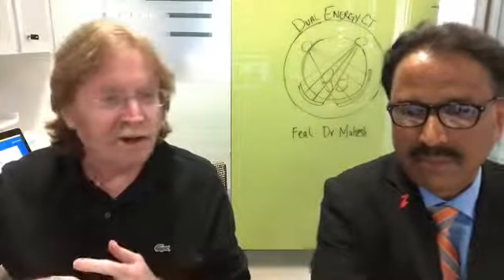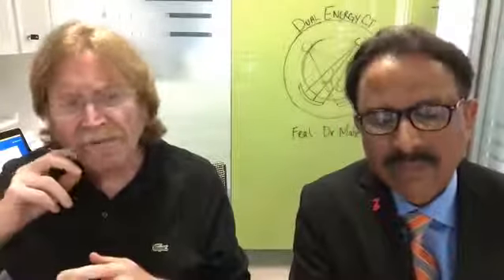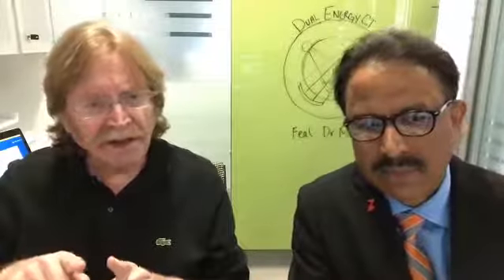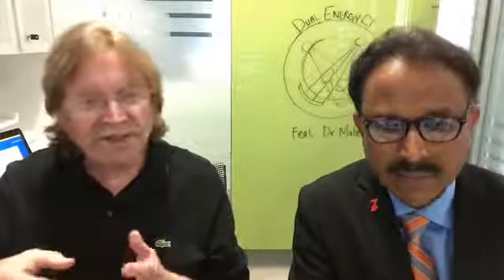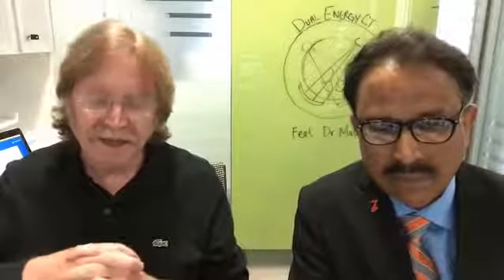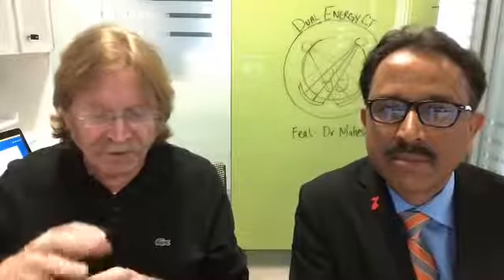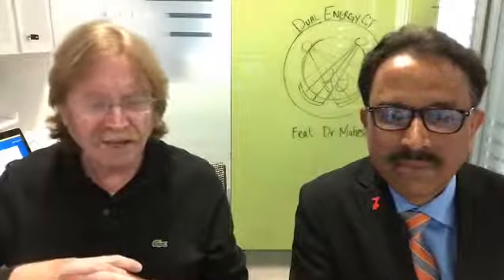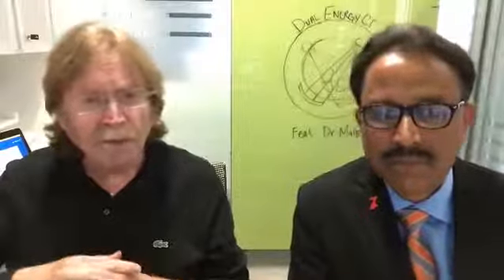We presented some work at RSNA talking about how, again, it's a little bit rough, but you can separate calcium and contrast. And so the question is, in peripheral vessels, can you really determine vessel patency? One of the challenges to date, and it's still a challenge, is that when there's good flow and there's a big vessel in calcification, it's easy to remove the calcification. When it's tiny vessels with minimal flow, you tend to overcall the degree of stenosis. But that's something that's being worked on.